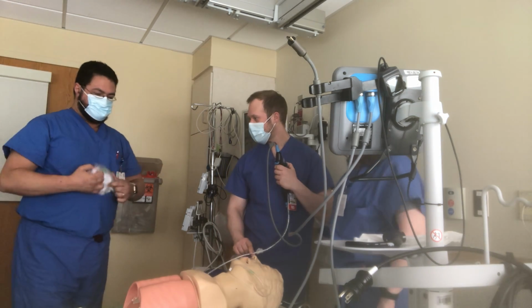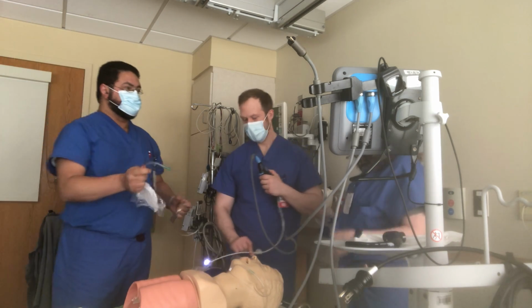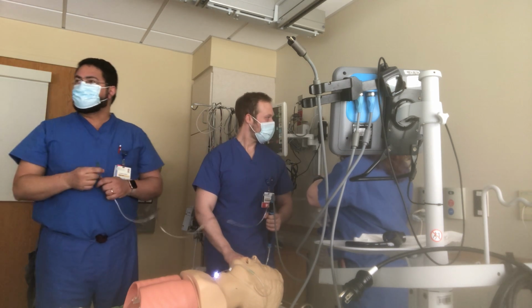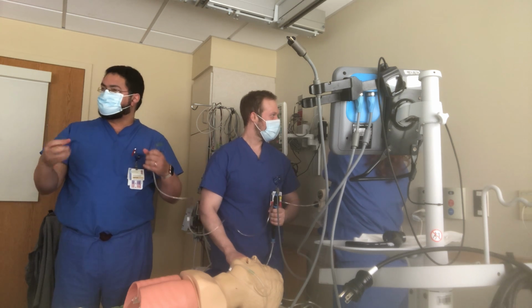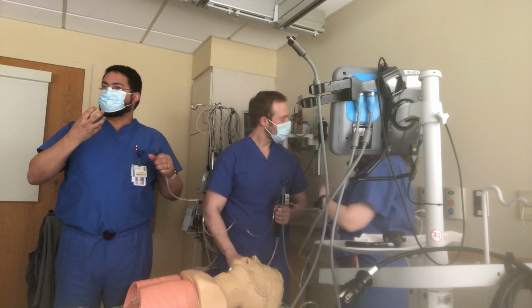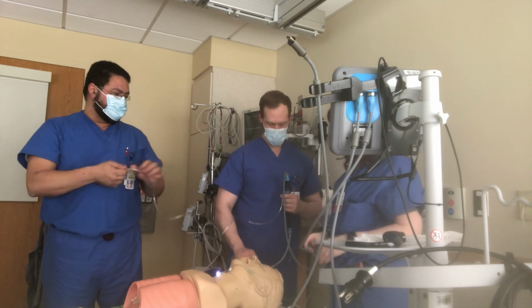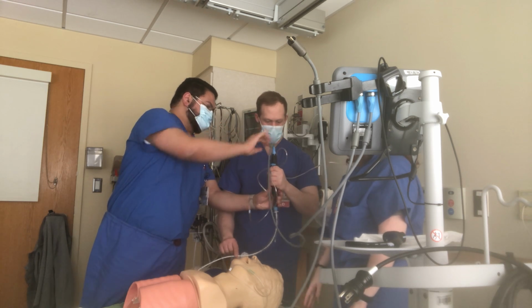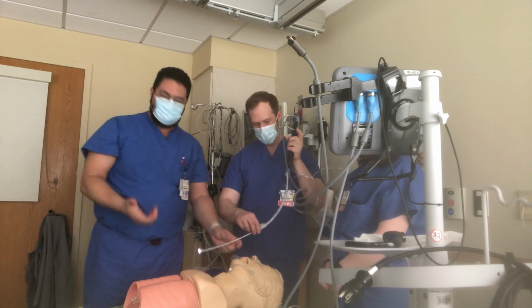And this by itself does a lot of good things for you. Let's connect this here. What it ends up doing is that it insufflates at 6 liters per minute, and that pushes the secretions away. It actually stents the airway open and gives oxygen to the patient. You can't ask for better than this. So every time you press this button, oxygen goes inside the patient. And we turn it like this, hold it with the left hand. He's never done one before, so.